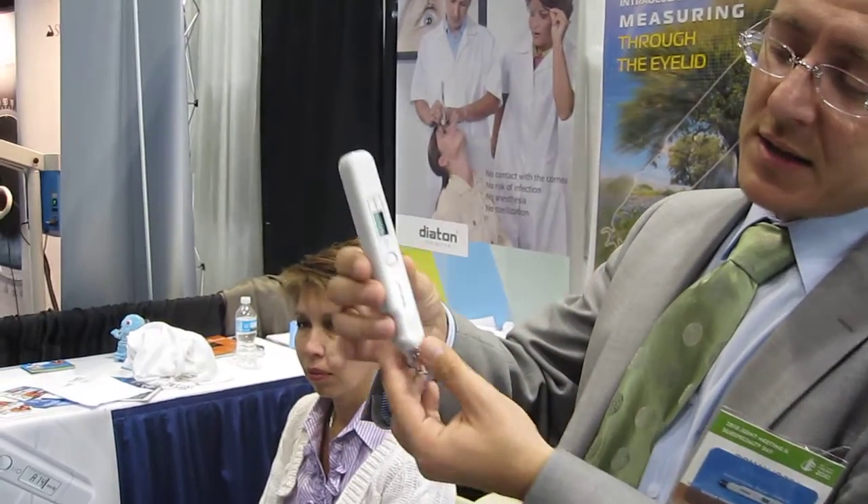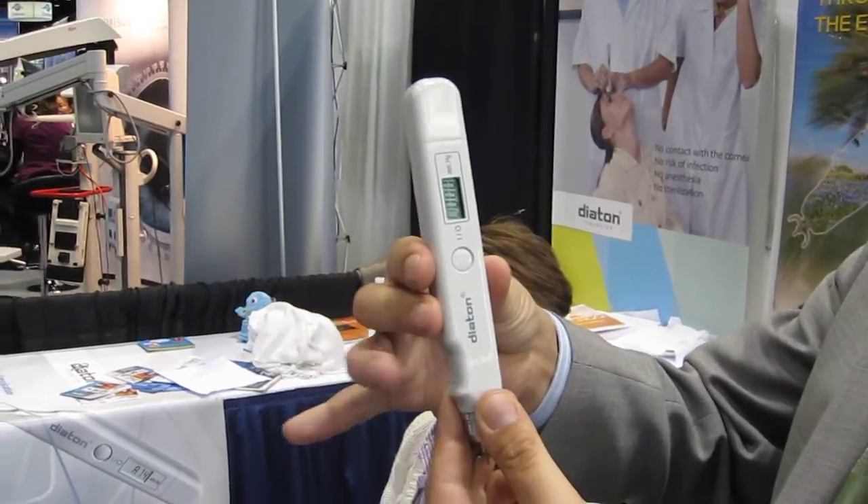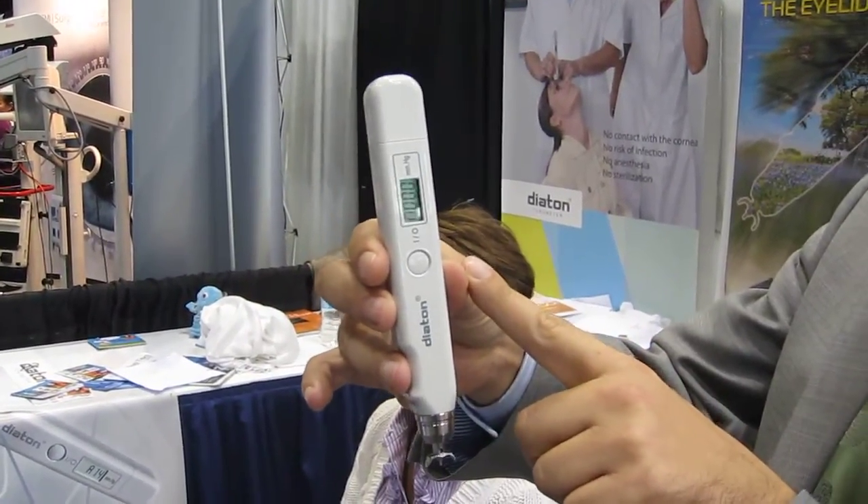The tonometer is operated with a single button which goes on and off, and has a little floater on the bottom. The way you would hold the device is three fingers on one side and a thumb on the other, like a flute.